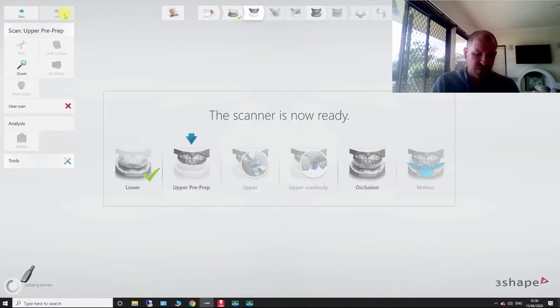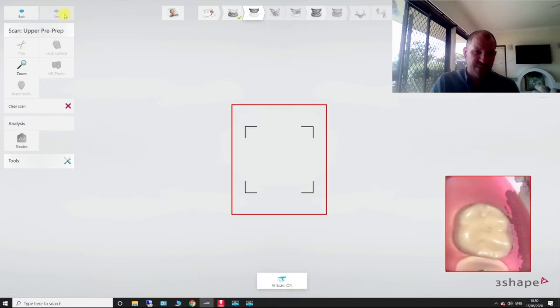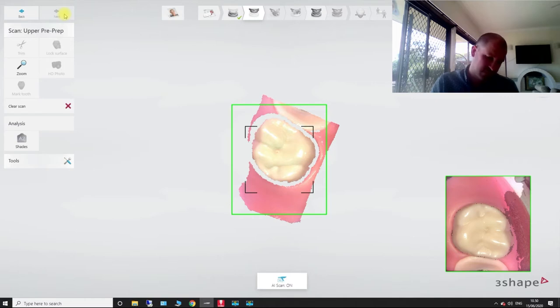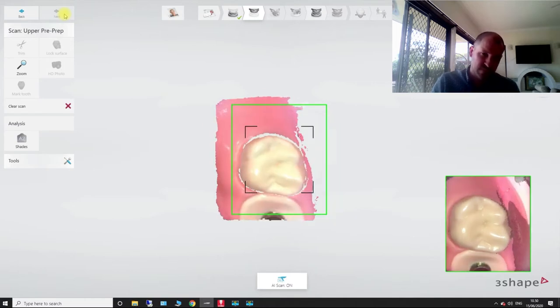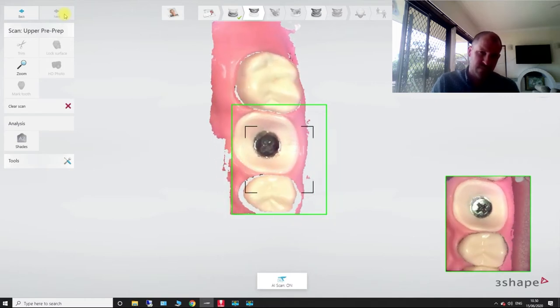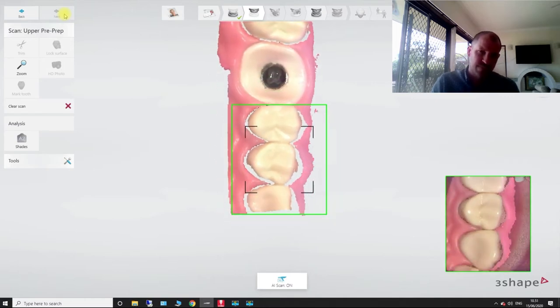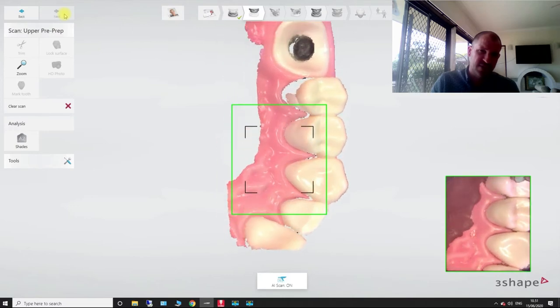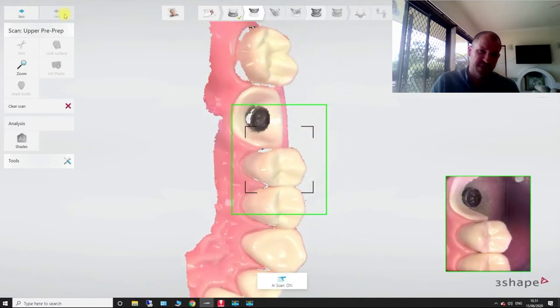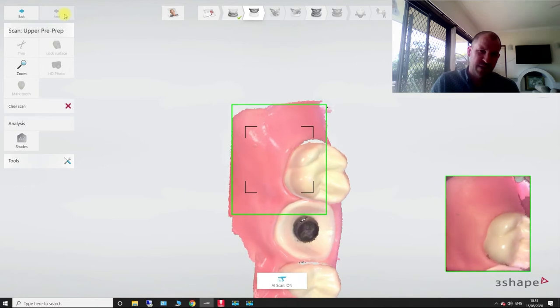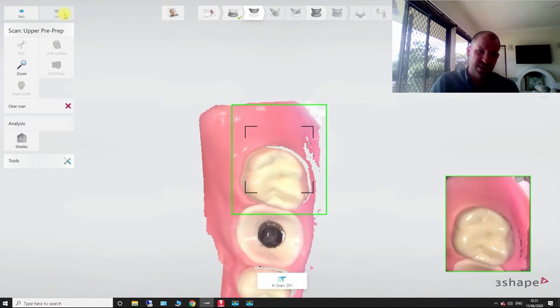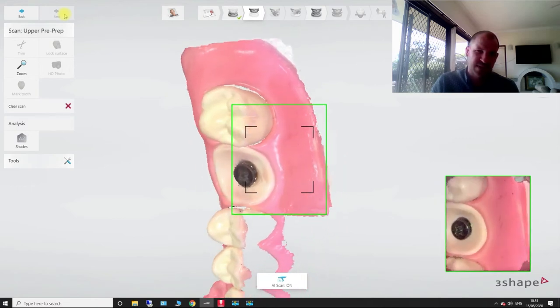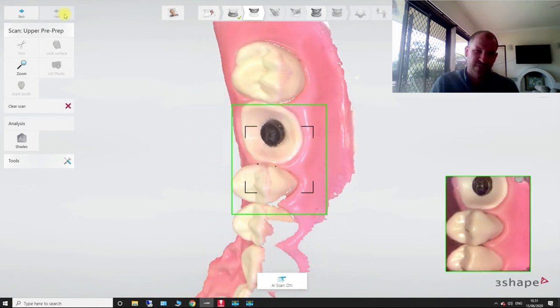So what we're doing is we're going to be scanning this with our healing cap still in there. Now, I've just literally just got a Phillips head screw in here. But you'll have to just bear with me because I don't have a healing cap in this particular model.